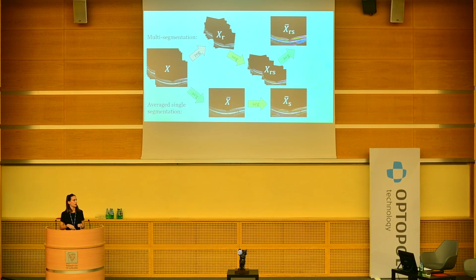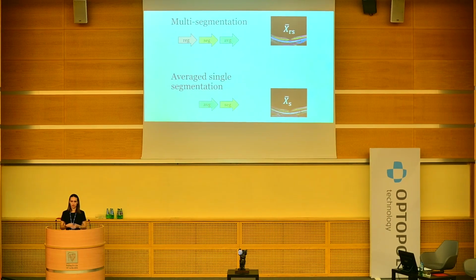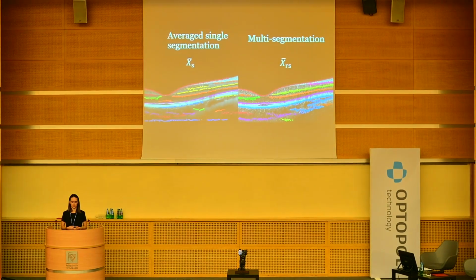As you can see at the bottom of the slide, the average single segmentation method is presented to compare with the multi-segmentation method. The average single segmentation takes into account the set of X, averages its elements, and performs segmentation on the average result. And as you can see, the multi-segmentation method has its potential in the task of retinal registration techniques in OCT technology.